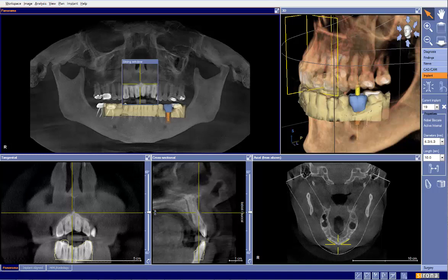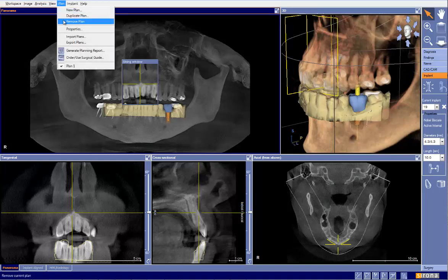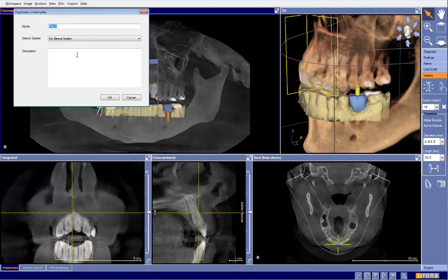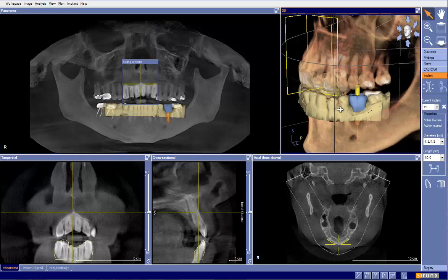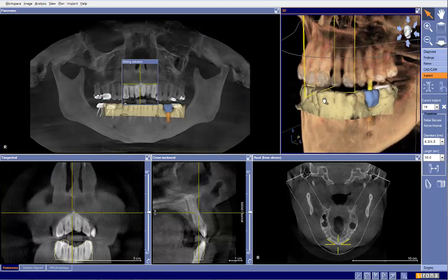We have a case here for an edentulous site, tooth number 19. I went ahead and planned — there's the plan. I'm going to go ahead and duplicate the plan, which is typically what I'll do, so that we can compare my plan versus the original plan. I haven't spent much time looking at this, so we're going to do this on the fly.